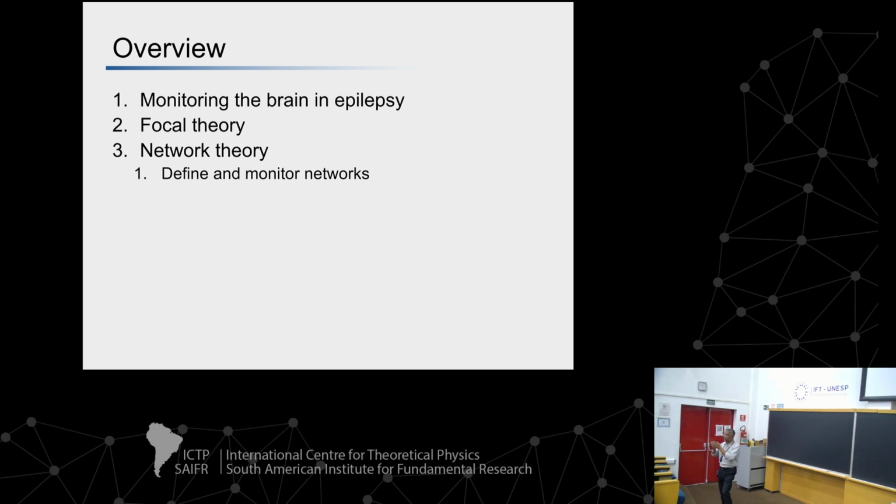But if we believe in the network theory of epilepsy, we need to change how we place electrodes, where we place electrodes, what information we collect before the decision, because you can only measure if you place electrodes there. If you're not placing electrodes to measure activity in certain nodes, you're not going to pick up the network expression. At best, you're going to have a sort of incomplete picture. So we've got to better understand how the network theory should define, how we can define these networks, how we can study them, and then how can we control them. So it's quite a paradigm shift.